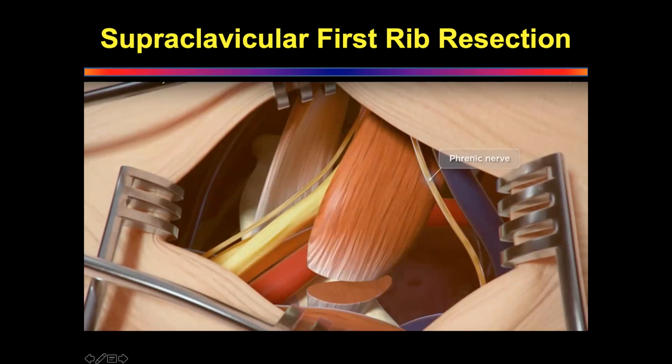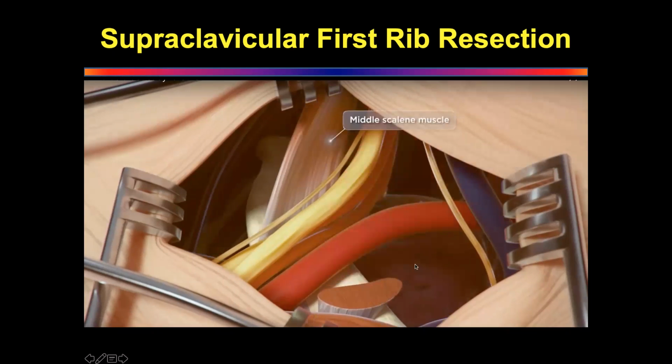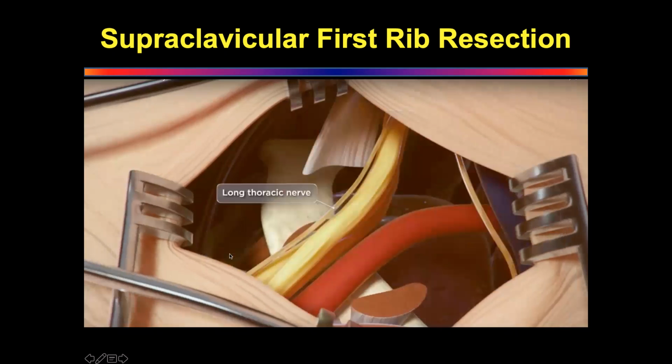Okay, so here the scalenus anterior is divided. What do you have to be careful about in this area? The brachial plexus, not to cause injury to the brachial plexus. On the left side, the thoracic duct. Good. And also the phrenic. The phrenic runs in the lateral angle of your incision, so you have to be careful. You have to identify the phrenic, always, otherwise you'll cause paralysis of the diaphragm. So you divide that, clear out this area, and cause the thing to open up.